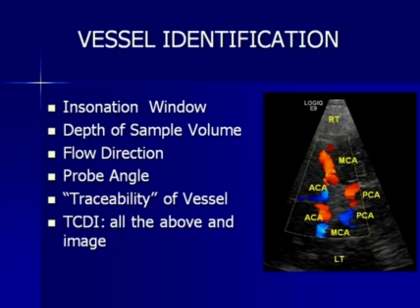Here we have an image coming from a transtemporal approach, as we can see here. And in order to figure out what vessels we're looking at, we need to know what window we're looking at. So if you have a standard protocol, that needs to be documented, or if you're evaluating, some information should be displayed for the interpreting physicians.